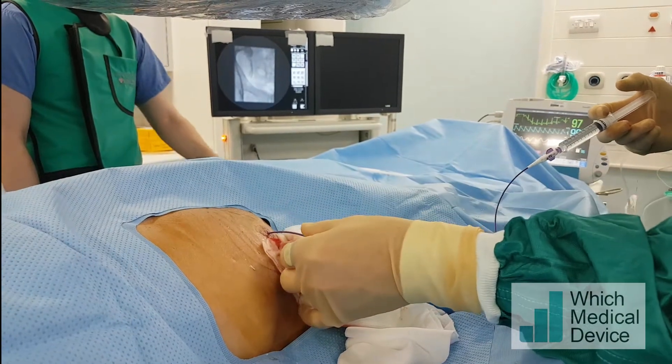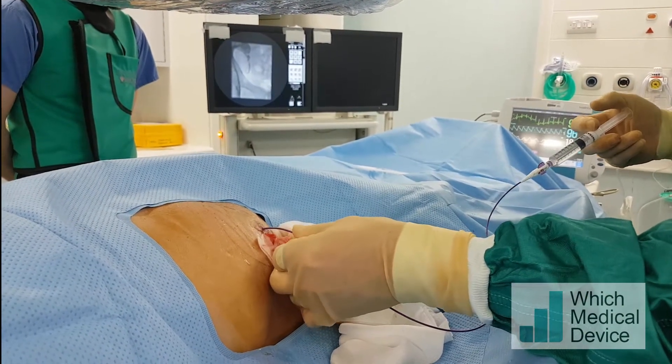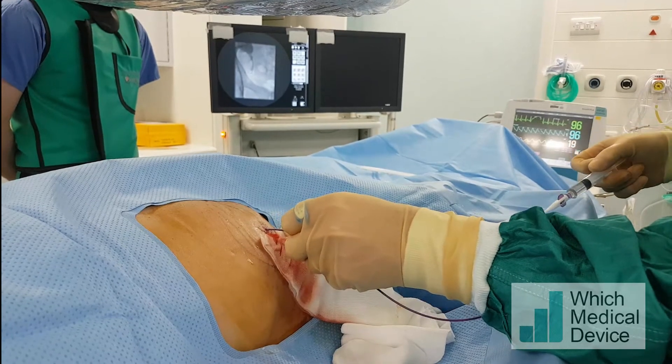I'm just injecting some contrast into the distal ureter near the area of the stricture — right up to the stricture. There's nothing going through, or very little, at the moment so it really is very, very tight.